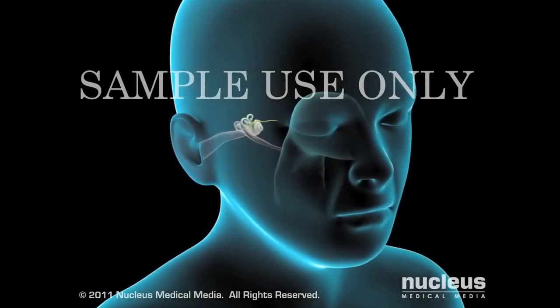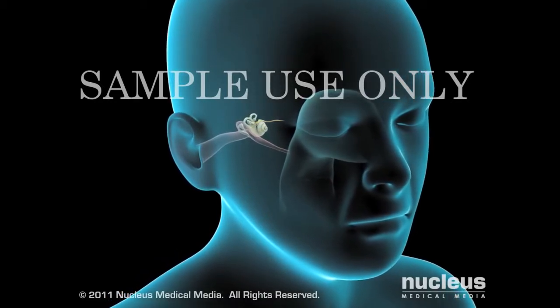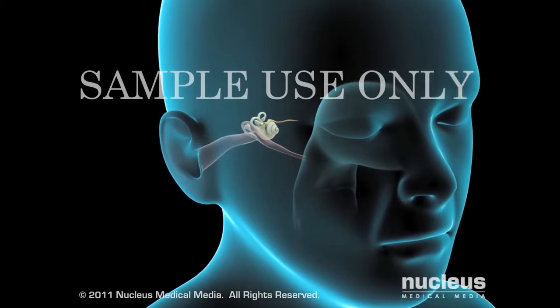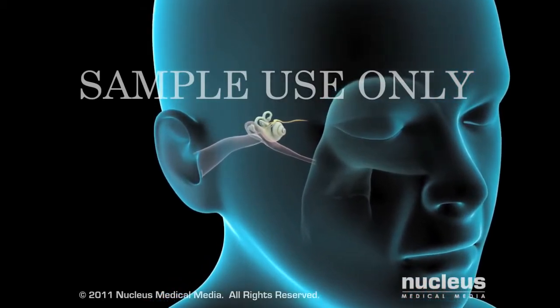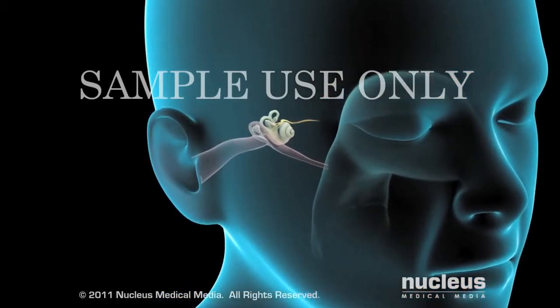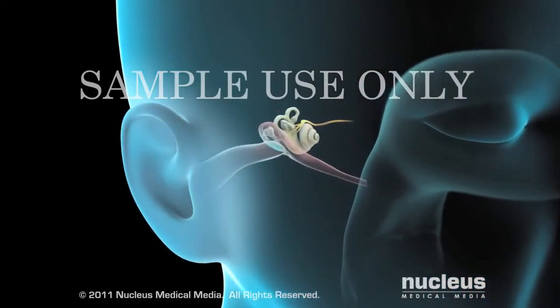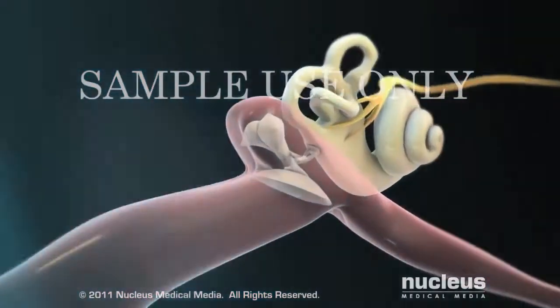A myringotomy, also known as a tympanostomy or tympanotomy, is a surgical procedure to remove fluid in the middle ear and reestablish equal air pressure on both sides of the eardrum.